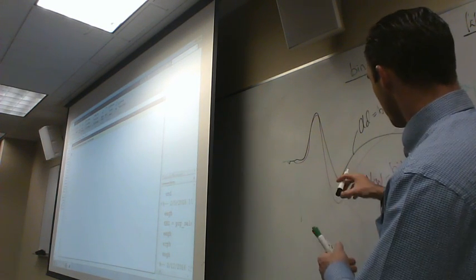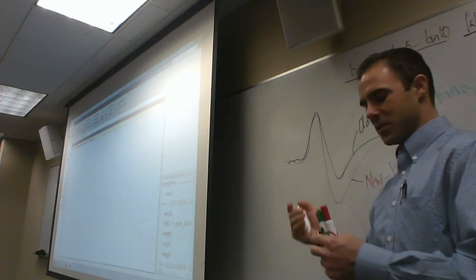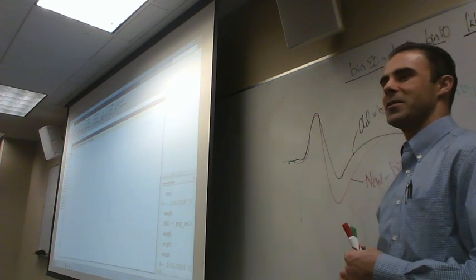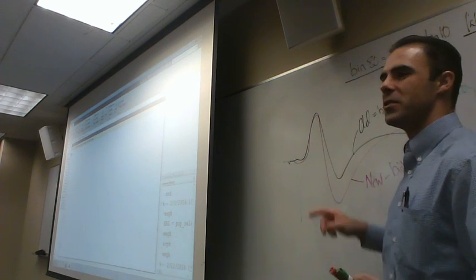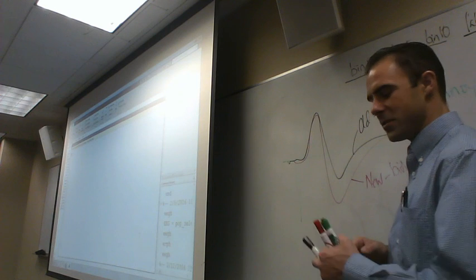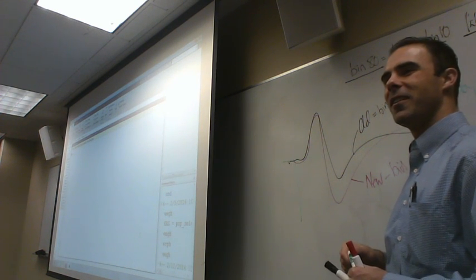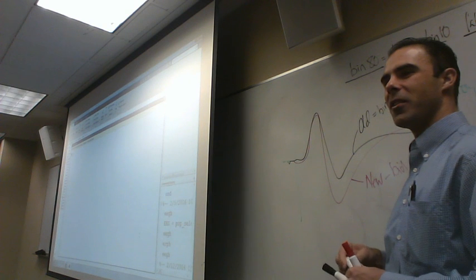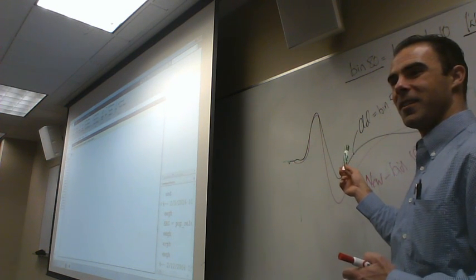So what would it look like if we plotted the difference wave? It's going to take some mental gymnastics because we haven't talked about this yet so much. If you plotted the difference wave of these conditions, what would it look like plotted up against here? All right, Tom, come on up and show us. In between them there. Can you show me?